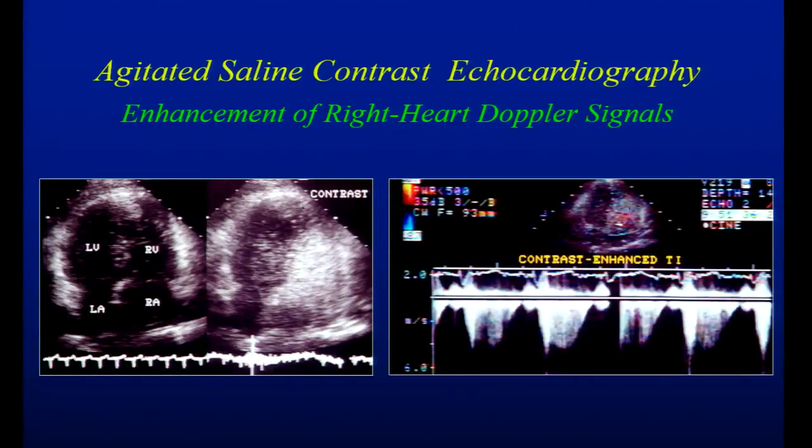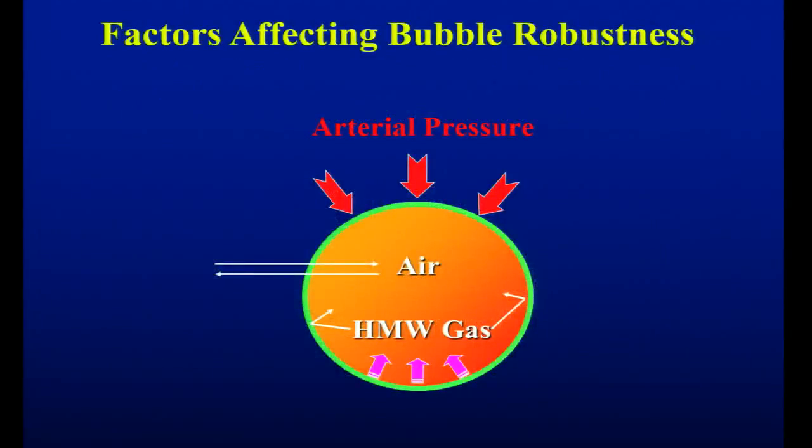How do you enhance it? Because if you have more, how do you get a Doppler signal? You get it because of reflectance from the red cells in the blood. So just imagine if you have other microparticles that are quite reflectant of ultrasound. You will enhance that signal, and if it is important, you'll use saline contrast to try to enhance that. So that's the extent actually of today of how much we're going to talk about saline contrast or agitated contrast of fluid.